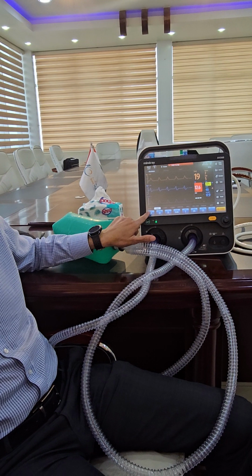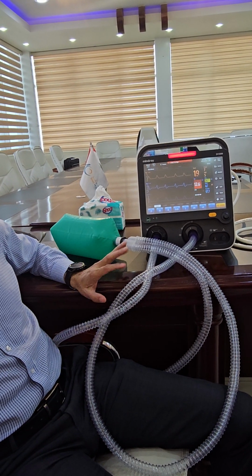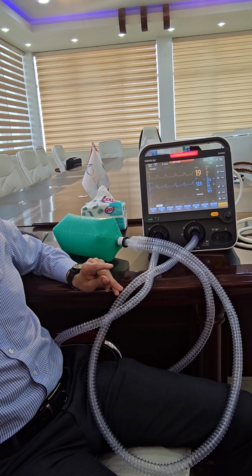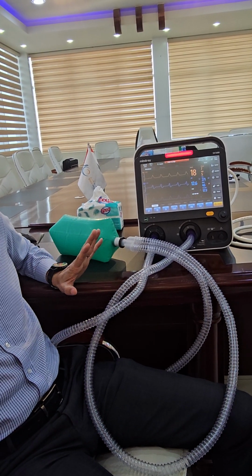And how many types do you have? Two types: volume and pressure. Then we have conditional variables, dependent, and phase variable, and type of breath. What does it give you? Mode. Mode of ventilation. Is it clear?